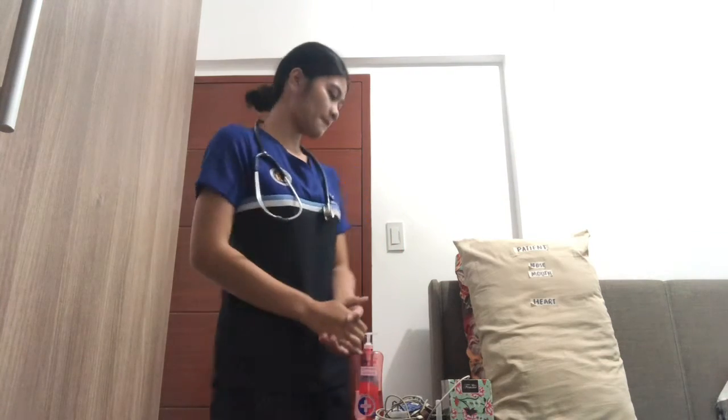So, after that, we will gather all the required equipments and check if the medication is available, and also ensure that the medication expiration date is current. So, first, before gathering the equipments, we will first check if the medication is available.